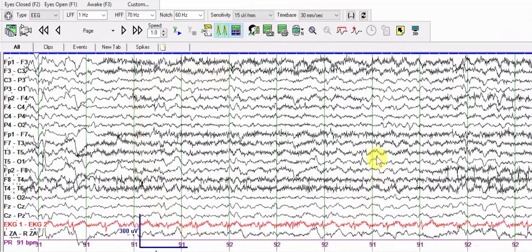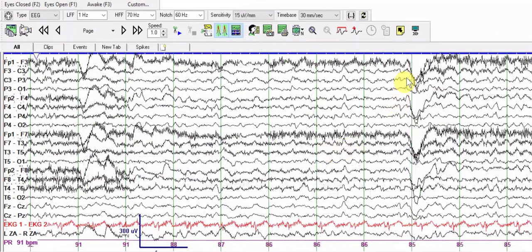We see Delta and Theta frequencies. Delta frequencies are less than 4 cycles per second; Theta is between 4 and 8 Hertz. Normally in an adult patient in quiet restfulness you would see an occipital dominant alpha rhythm of 8 to 13 Hertz, which we do not see here. We are seeing a mixture of Delta and Theta with some superimposed beta activity.